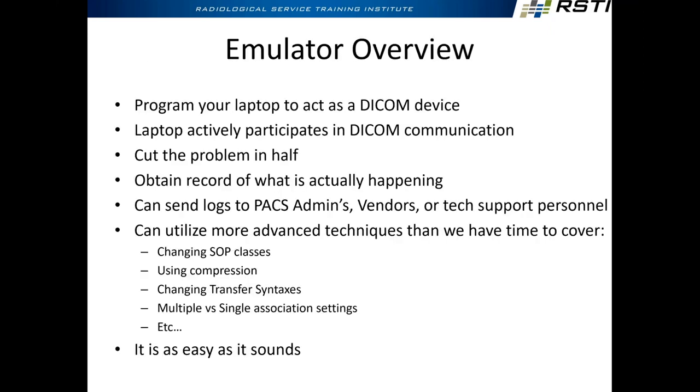And I go through the same thing. And the last slide here, as an overview: emulators are programs that allow our laptop to act as a DICOM device on the network. The laptop actively participates in the DICOM communication, meaning it sends or receives. We have a 2-week PACS class. We do some really advanced troubleshooting stuff.